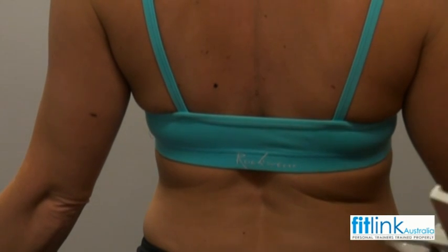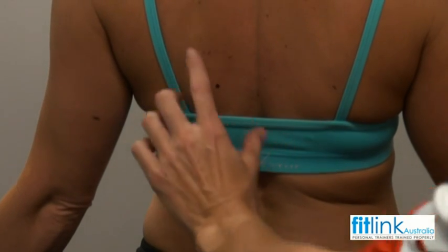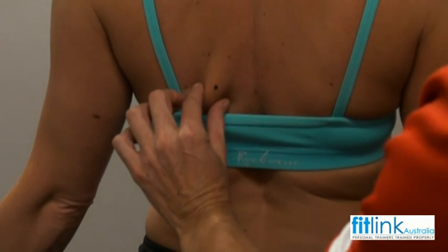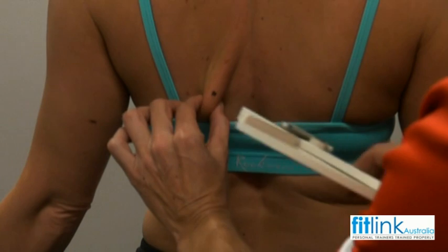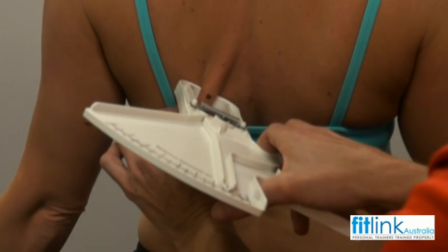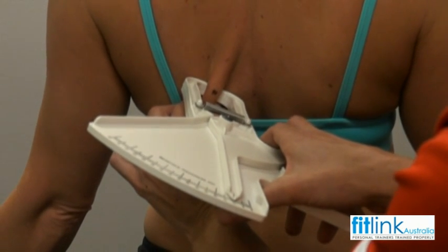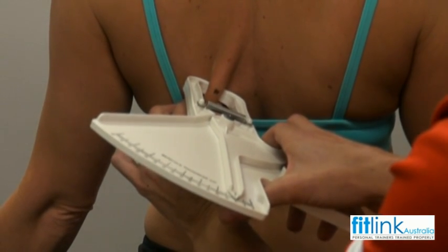Now I'm just going to do your subscapular. The muscle of the subscapular wraps around here, so I need to grab across your muscle, making sure that point is in the middle of my pinch, and putting the calipers on. The reading there is 10 millimetres.